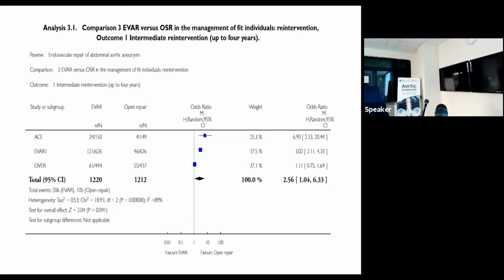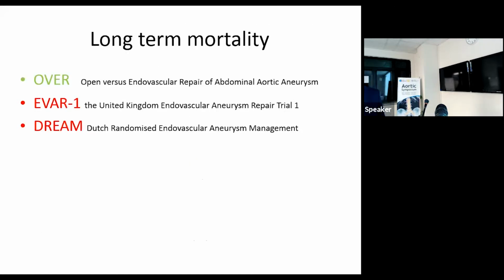And the final thing that I want to point out here is reintervention rates. And this could be considered the Achilles heel of EVAR because we know that there is a higher reintervention rate. So here it's favoring open surgical repair. So these patients do have a higher reintervention rate, but the reinterventions may not be that invasive. EVAR itself is not invasive, and it's something that can be dealt with. But we'll talk about all of these things a bit more as well.